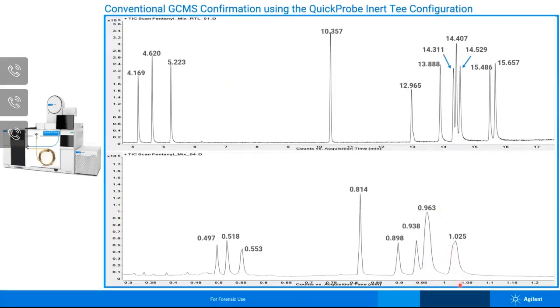And in the last 2, cyclopropyl and crotonyl fentanyls, we've got coelution as well into one peak. But we have separation of our early eluting and our mid eluting fentanyl analogs. So it's just in these last two that we're zoomed in on that we have a coelution effect.